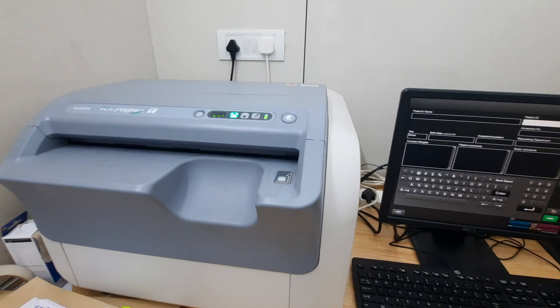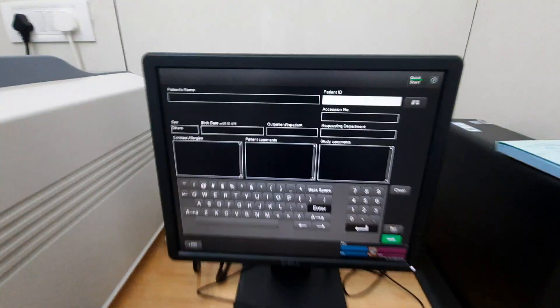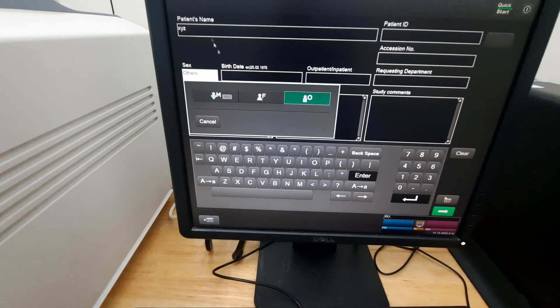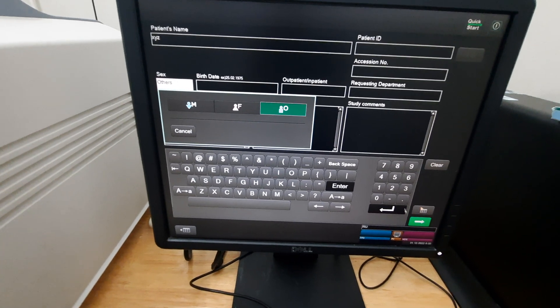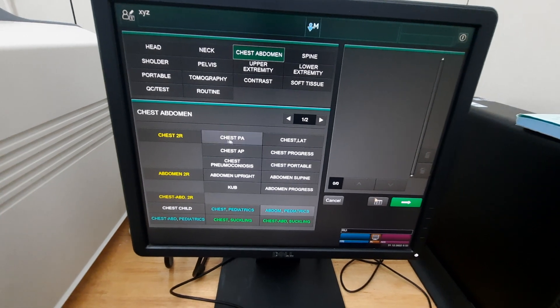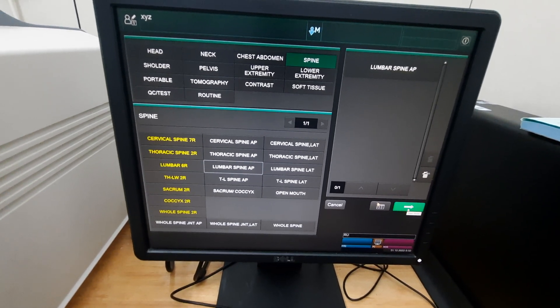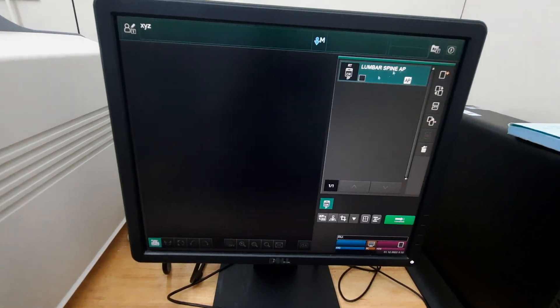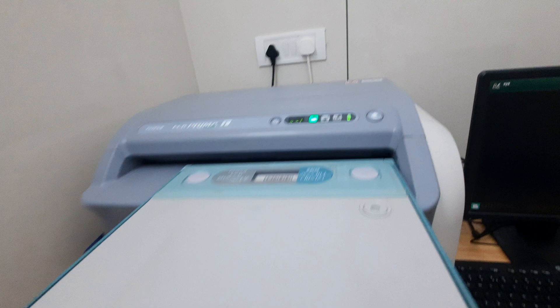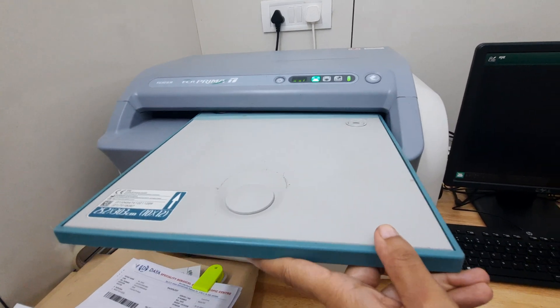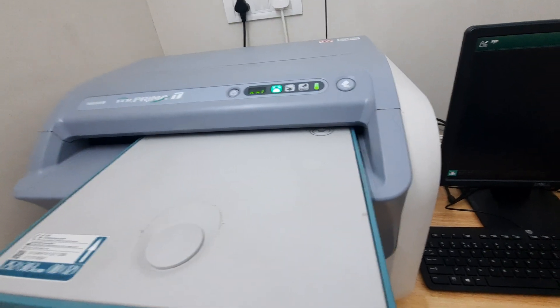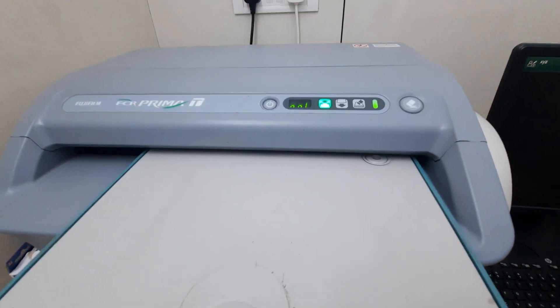This is the CR cassette reader and this is the computer screen. First, we enter the patient's name, select the gender, enter the age, and select the body part — for example, chest or spine. Once the body part is selected, we insert the cassette. Once the cassette is inserted, the image captured inside it will be read by the computer system.